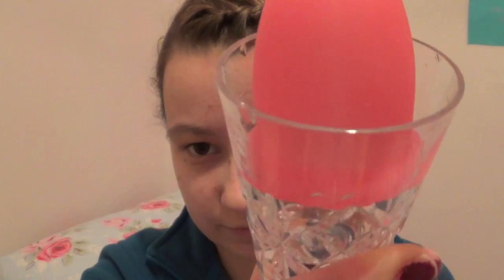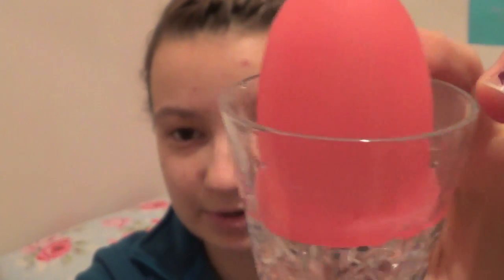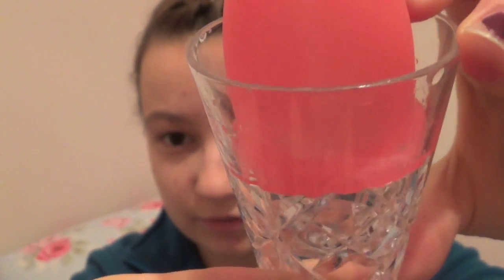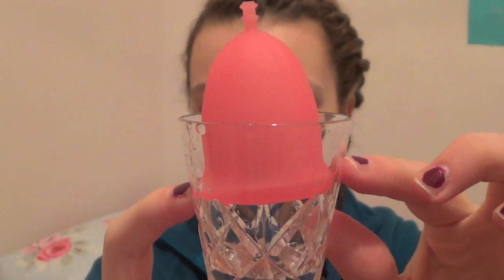And even here you can see how with this cup, the air hole, let's try to find it somewhere, where is it gone? Here too. Okay, you're not going to be able to see them very well, but there are 2 holes just on the cup here, and you can see the rim isn't completely attached, but even then this cup still won't leak, which is great. So, next thing that could be the cause of your cup leaking, if your cup is too small.